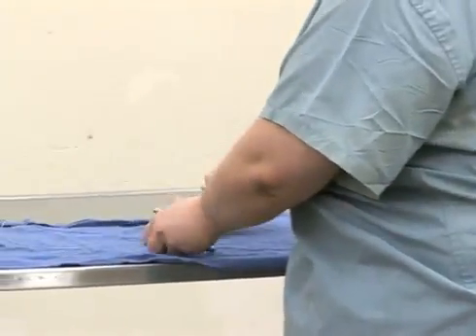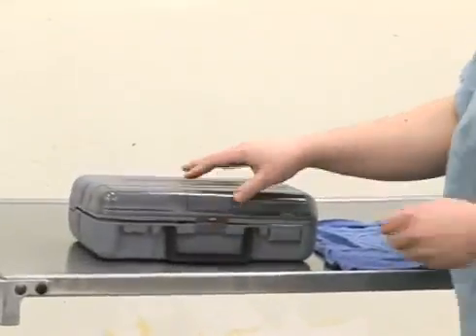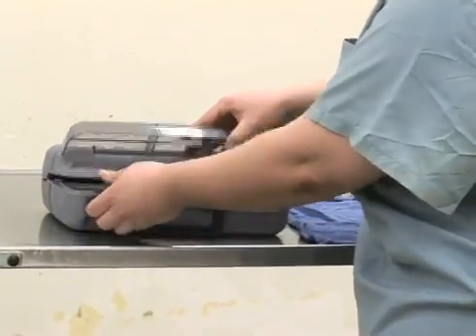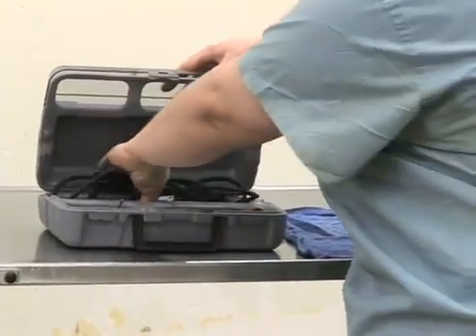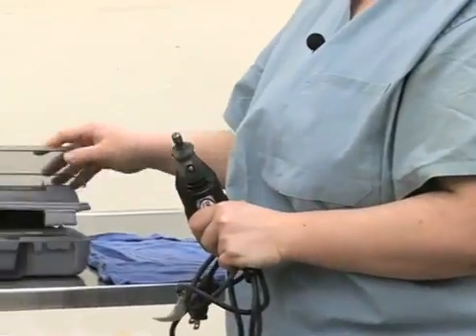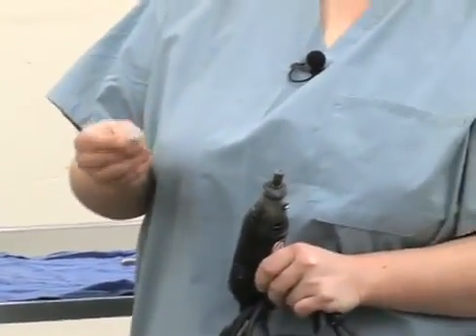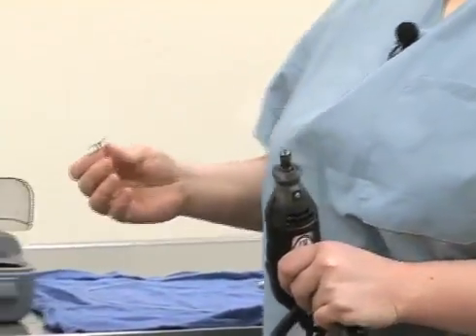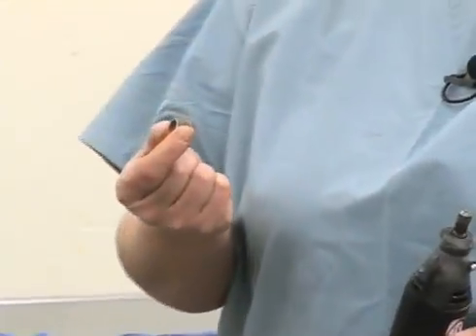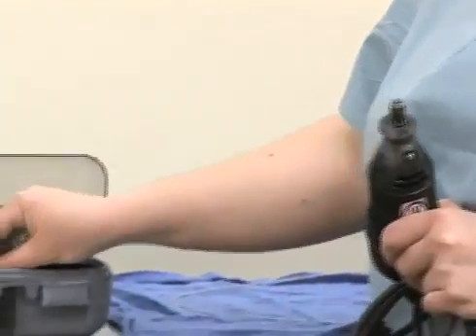The other potential option for removing fighting teeth involves the use of a Dremel-type machine. This is probably best performed with the animal sedated, because of the potential for cutting the mouth if the animal can move easily. We typically use a circular cutting wheel, as opposed to just sanding with an abrasive surface like sandpaper, although both techniques can be performed depending on how much tooth needs to be removed.